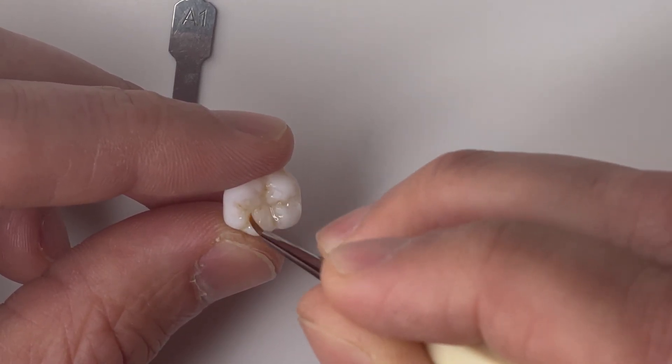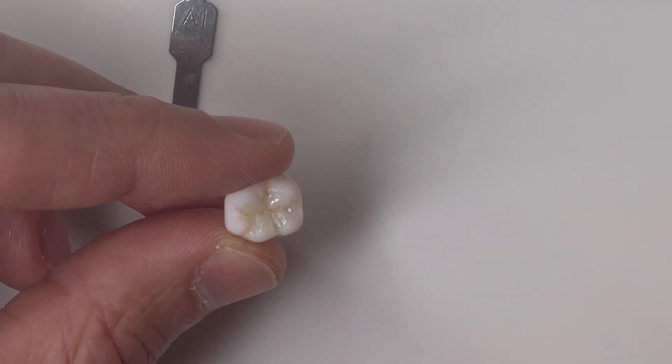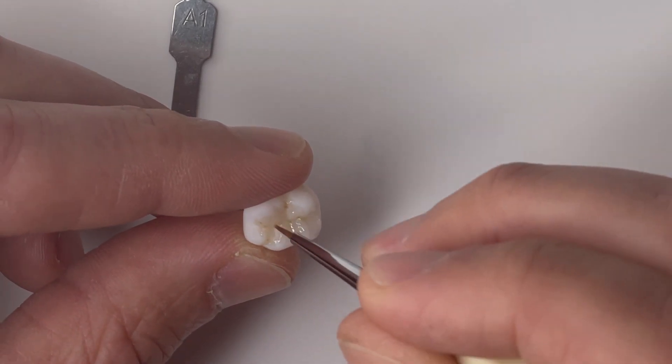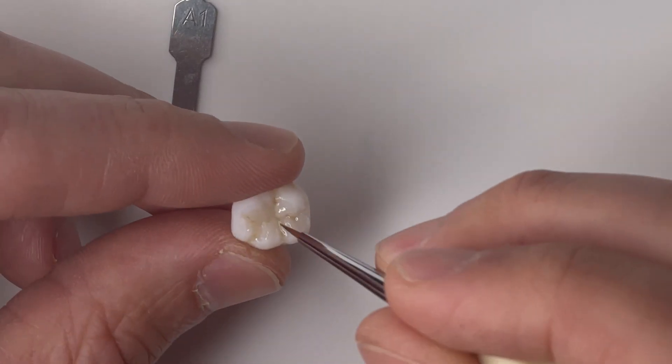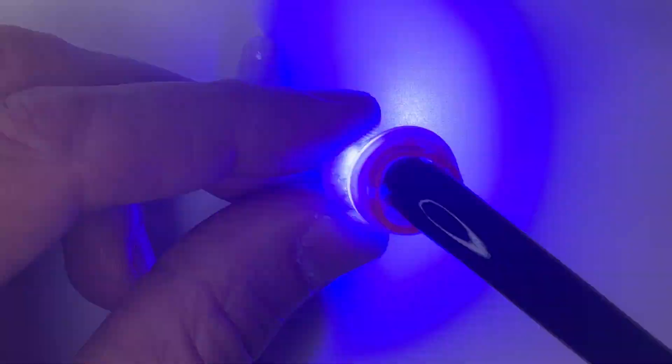You don't necessarily have to add more stain in the pits and fissures — it depends on the outcome you're hoping to get. But now I'm basically spreading it out throughout the rest of the occlusal surface. We'll go ahead and cure that.